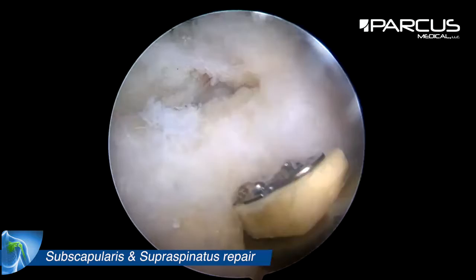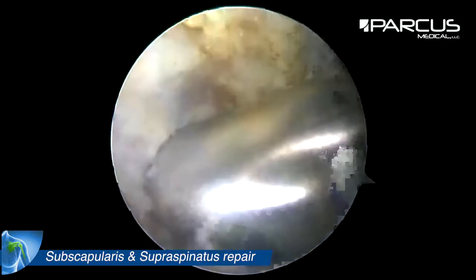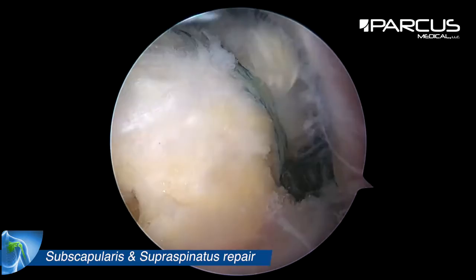And we then create two holes on the lateral part of the greater tuberosity, and we insert two screwing anchors loaded with the previous sutures.